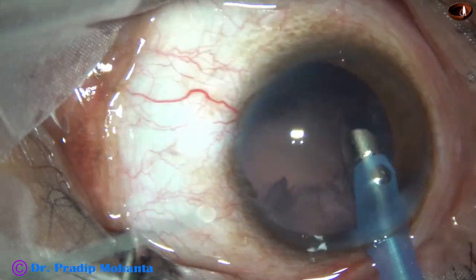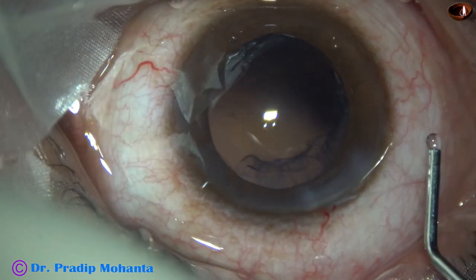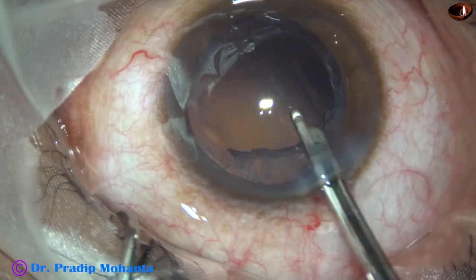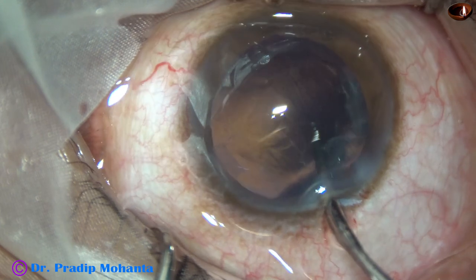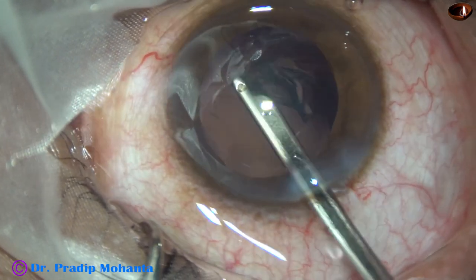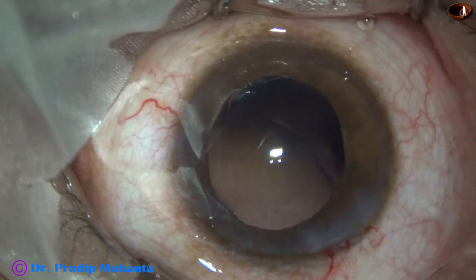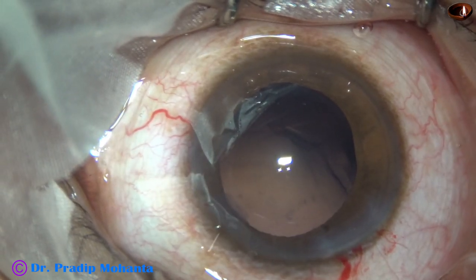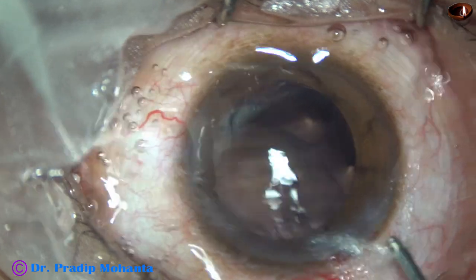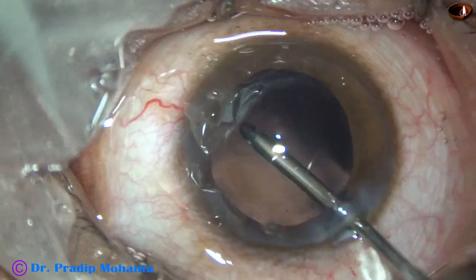This patient is only 27 years old, so in such cases the chance of posterior capsular opacification is very high. What I say to the patient on the operating table itself is that he will require YAG laser capsulotomy after a few weeks. I told this patient he can get it done after one month, because posterior capsular opacification is likely to occur very early in young patients.